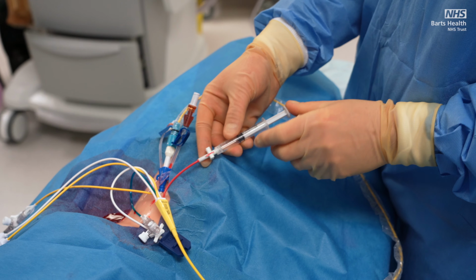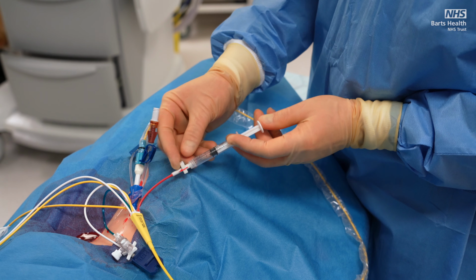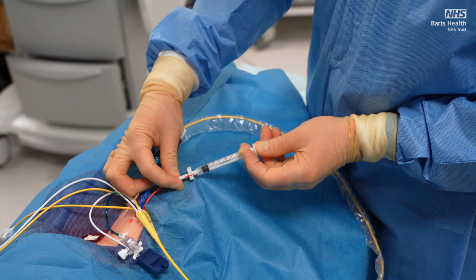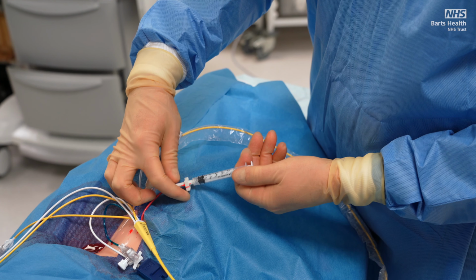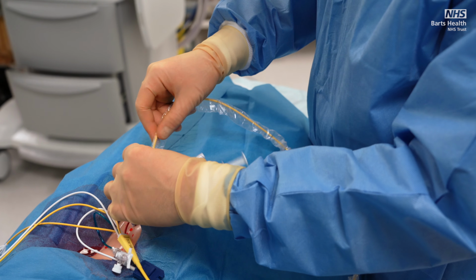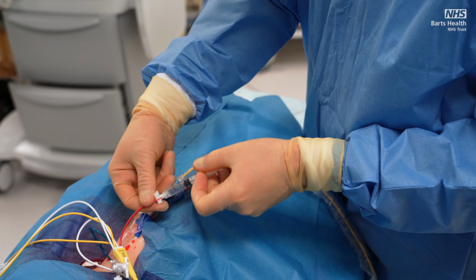Inflate the balloon with 1.5 ml of air and use the lock mechanism to ensure that the balloon remains inflated. If you have any resistance at this point, it is usually that the catheter has not exited the end of the sheath, and therefore deflate the balloon, advance around 5 centimeters and reattempt.